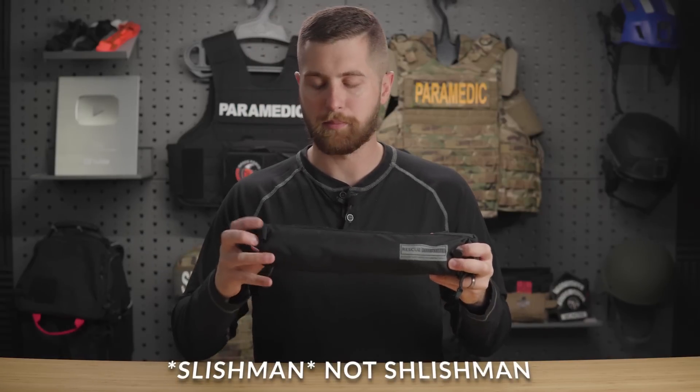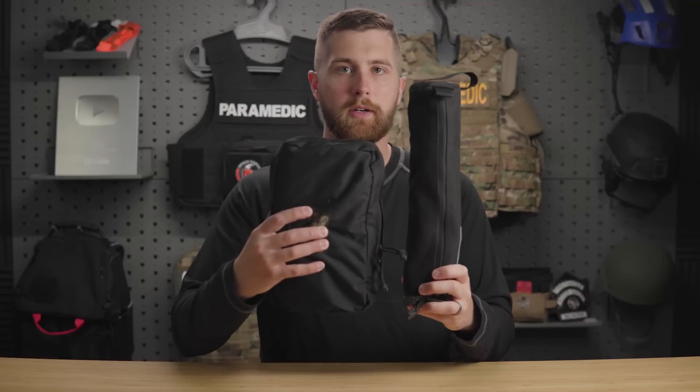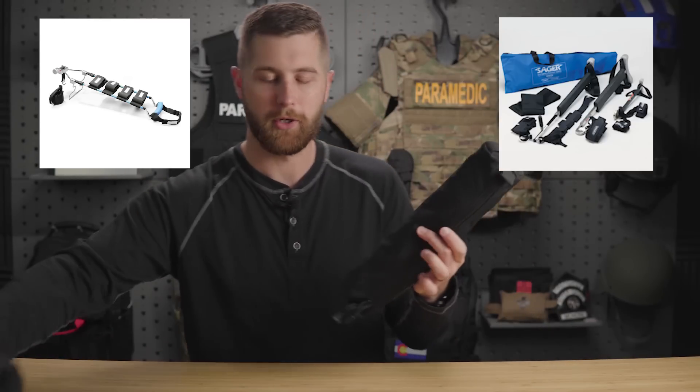However, the Slishman Traction Splint I think is a game changer, and I'm actually pushing really hard to get this on our ambulances and helicopters because it has so many advantages. First and foremost, the packaging it comes in is substantially smaller than other traction splints on the market. For those of you still using Hare traction splints or Sager traction splints, either of these will be a game changer. But this one is a lot lighter, a lot smaller, and can fit in almost any pack quite easily. They even market it for disaster medicine or search and rescue because it is so easy to pack into different kinds of backpacks and gear bags.